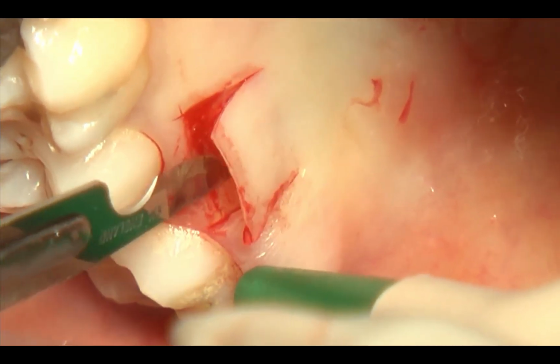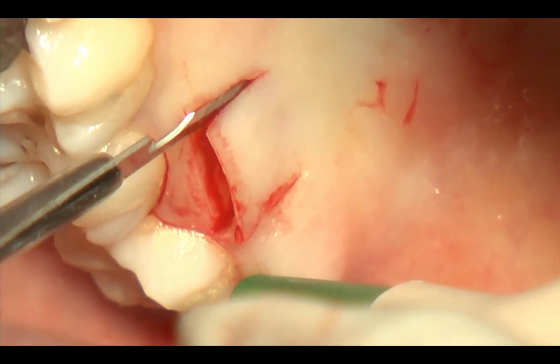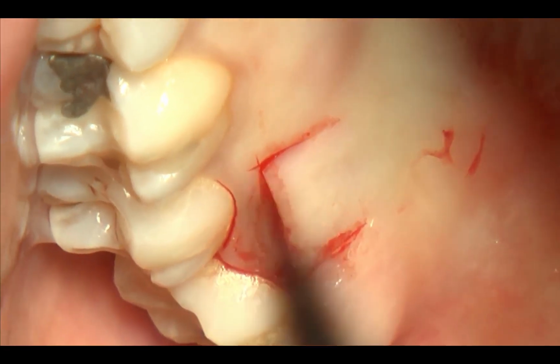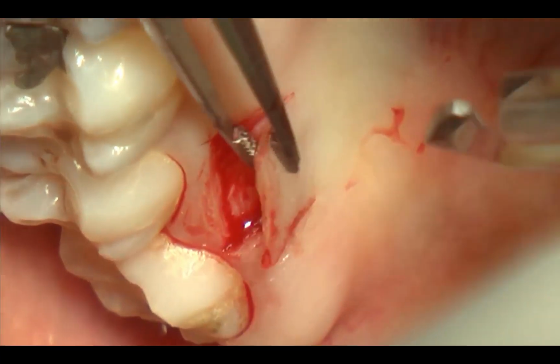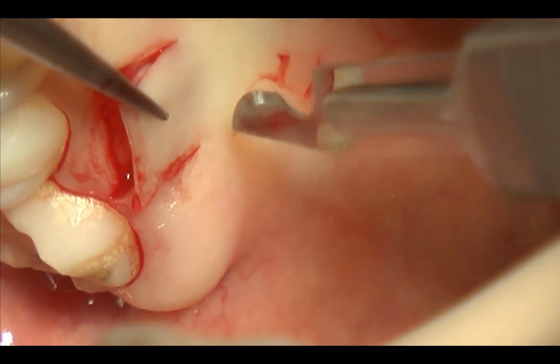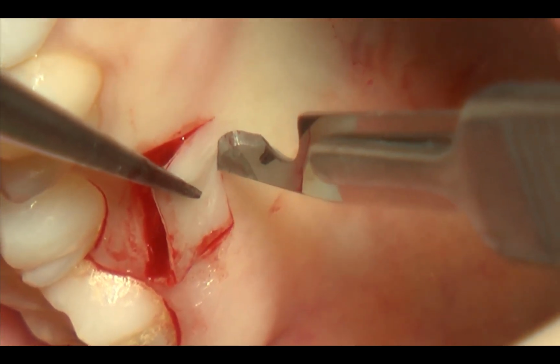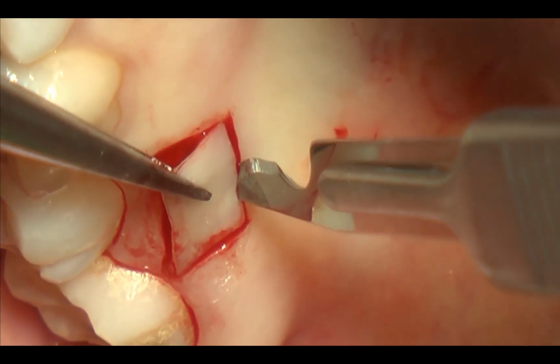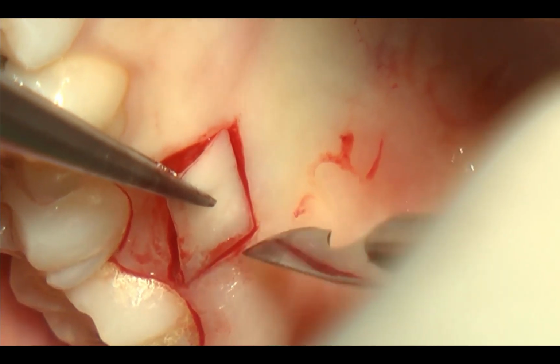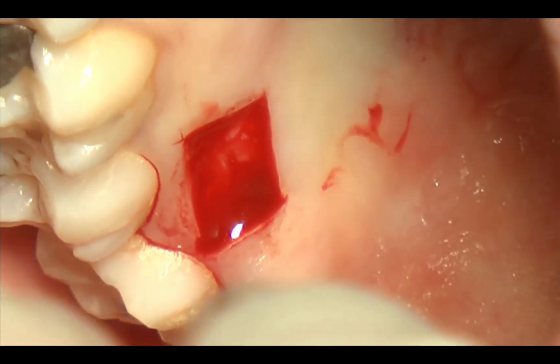Once the whole graft has been separated from the underlying tissue, it's time to connect the distal with the mesial vertical releasing incision. By making the distal and apical incision superficial, and then you get deeper and deeper until the graft is removed.